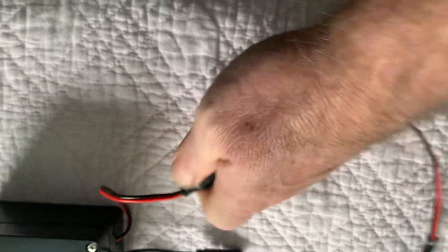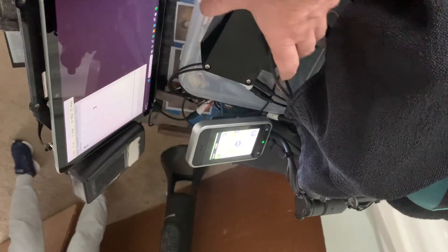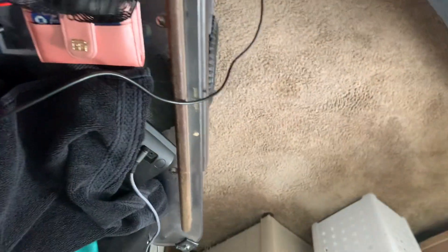We'll plug in the laser and take this over to Tanya, who doesn't know what she's doing yet. I'm going to commandeer one of her switches — she has a foot switch down there — and I'm just going to unplug her foot switch from here and plug it into this.